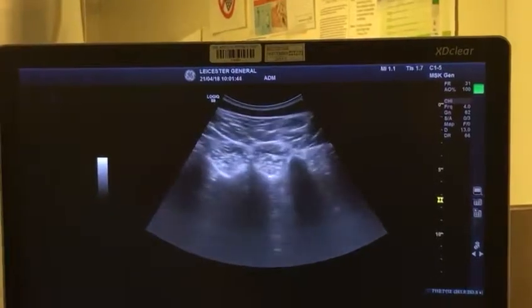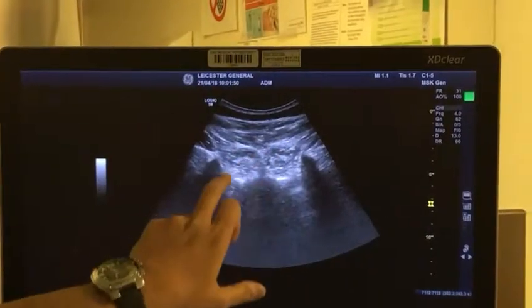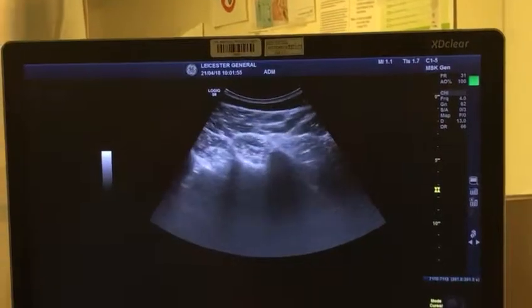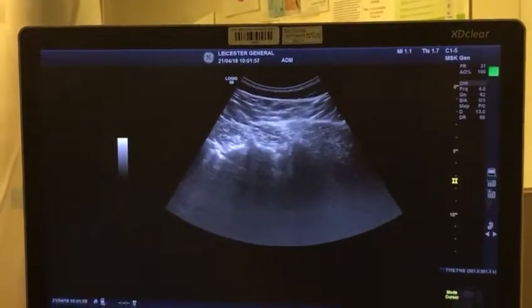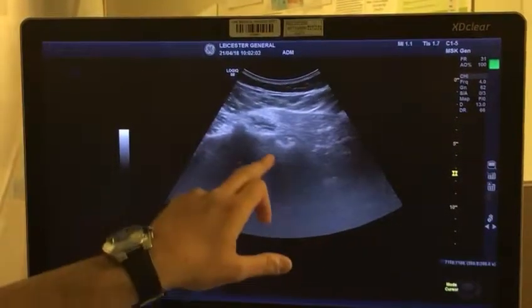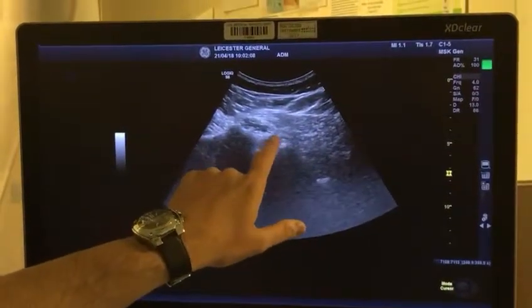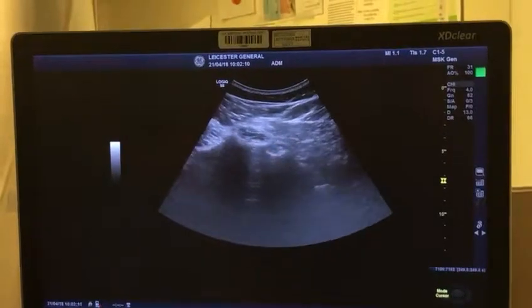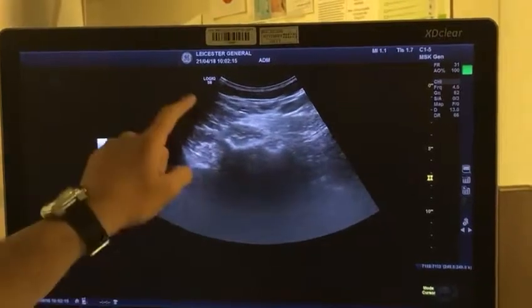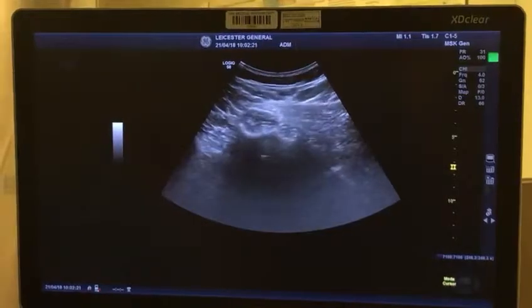Very subtle movement. So let's recap that. Midline, dorsal sacroiliac ligament, posterior superior iliac spine. Come down, S1 foramen. Come down, S2 foramen. And just at the S2 foramen, lateral sacral crest, ilium, sacroiliac joint. So the way you would do this injection is you bring the needle like that in the lower part of the sacrum, in plane. You're going to come there. That's your sacroiliac joint injection. So that's done.